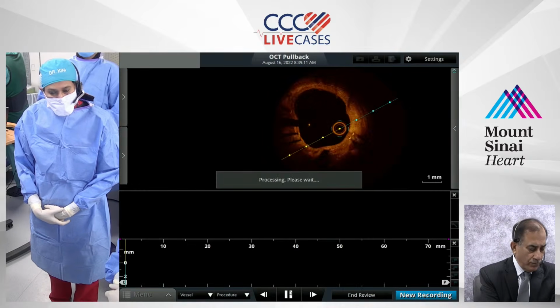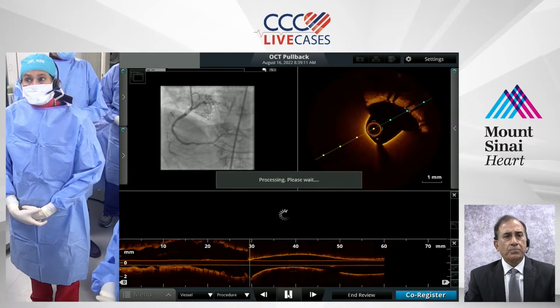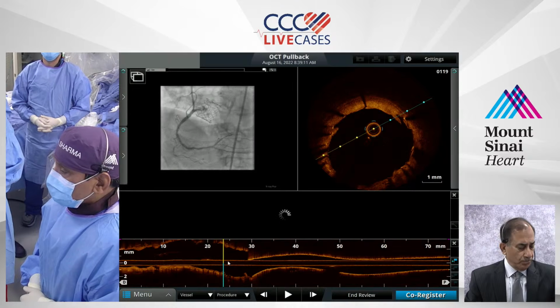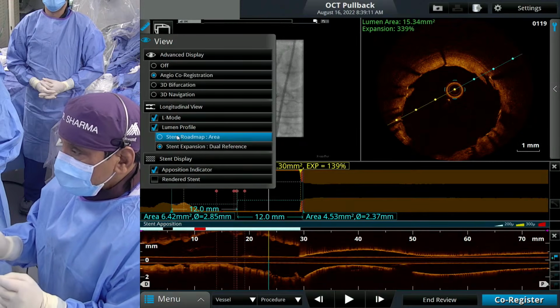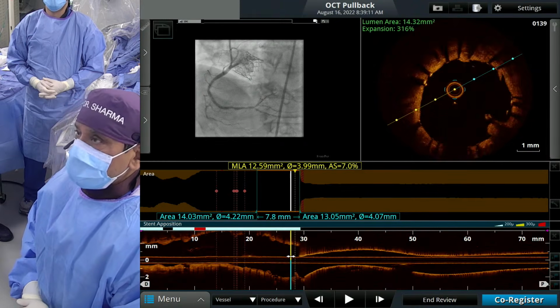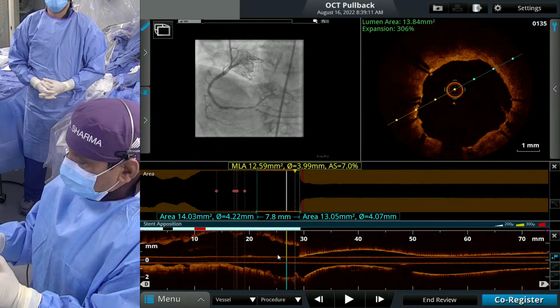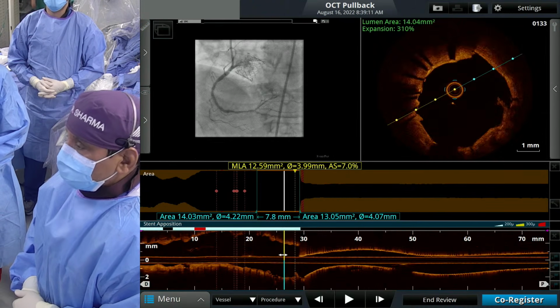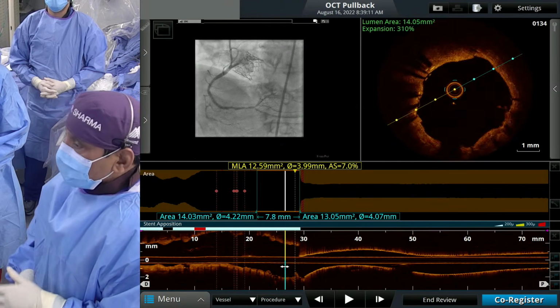We actually have published part of that also, and ISR when we wrote down the laser mechanism. So the author really wanted to understand how the laser works. Laser works for ISR, yes, but then there are papers about how the laser works in under expanded stent. So basically the vapors, the small bubbles, explode, particularly when you make a contrast injection, and that really expands. The laser energy, ultraviolet, goes behind the stent struts and liquefies that atheroma or calcium, which is preventing the stent expansion. So there are papers about under expanded stent using laser, not only ISR.